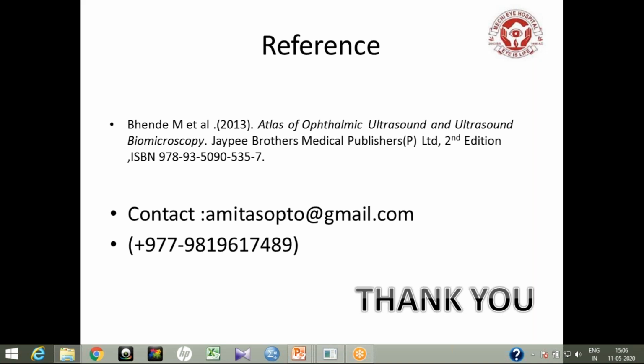Okay, sir. Actually, my question is, is there any other contraindication for USG? So in case of OGI, we do not suggest to do the B scan. Okay, sir. Is there anything special in children, where we can do the USG easily? Is there any advice if we are doing the USG in a pediatric population?